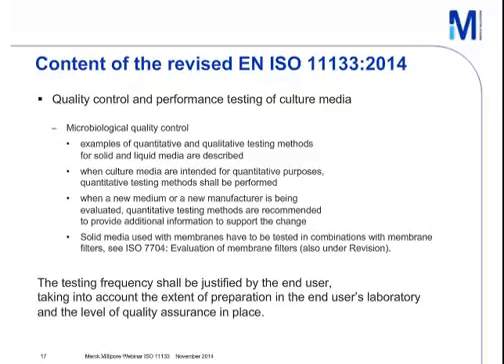When a new medium or new manufacturer is being evaluated, quantitative testing methods are recommended to provide additional information to support the change. And what is also very important is that solid media used with membranes have to be tested in combination with membrane filters. See the special ISO 7704 evaluation of membrane filters, which is also under revision. The testing frequency, a very important point for practical usage, shall be justified by the end user, taking into account the extent of preparation in the end user's laboratory and the level of quality assurance in place, for sure.